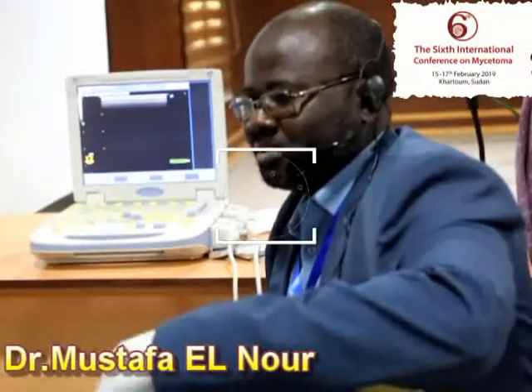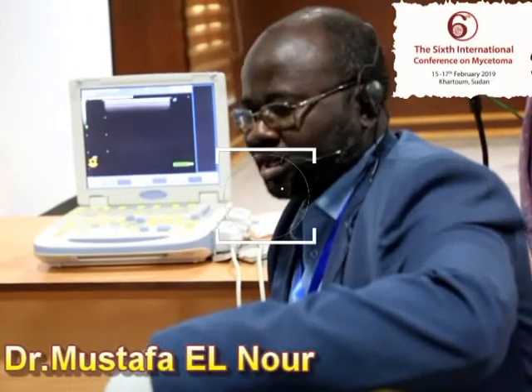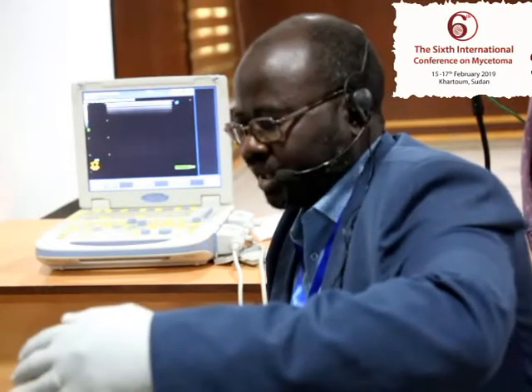Ultrasound is a tool to depict many conditions in the body, starting from the superficial organs like the skin and the subcutaneous tissue, going to deeper structures like the abdomen, where you can see the liver, the spleen, and the kidneys. And of course, as we all learned in the previous presentation by Professor Fahal yesterday, no part of the body is protected from mycetoma infection, unfortunately.